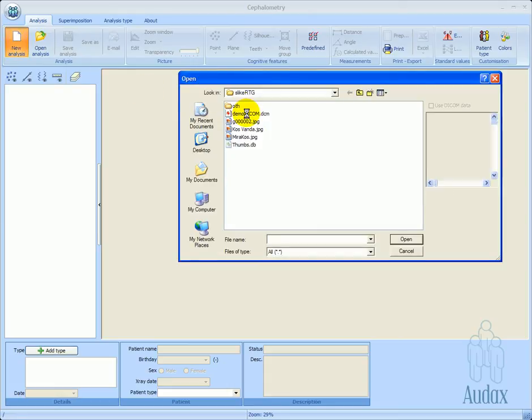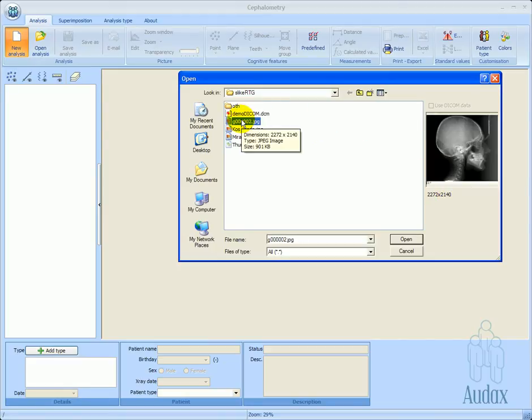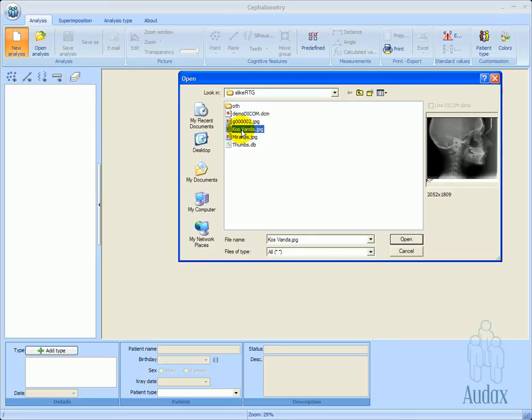To create an analysis, a lateral or PA x-ray picture is required. This can be any kind of DICOM file with its embedded patient data that can be automatically imported into an analysis, or just a simple image of any kind, like a JPEG, a TIFF, GIF, etc.